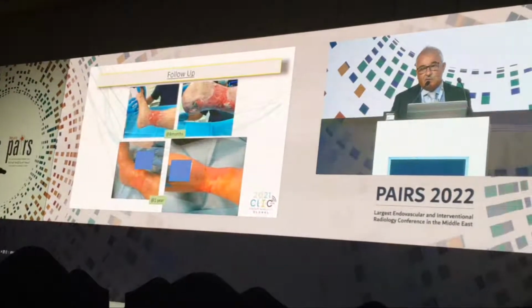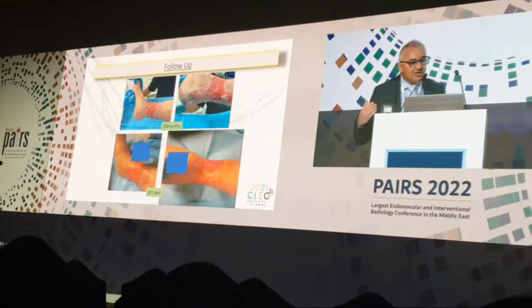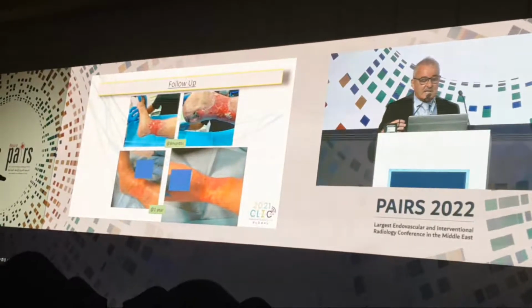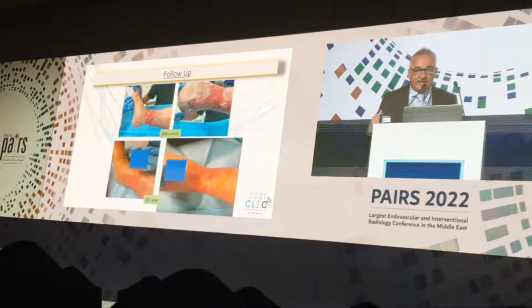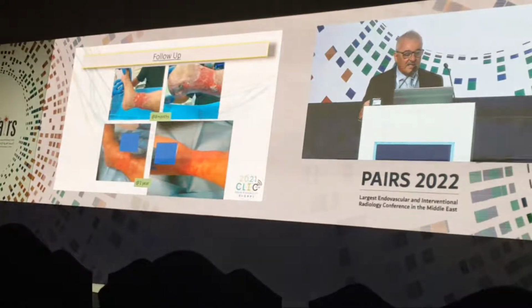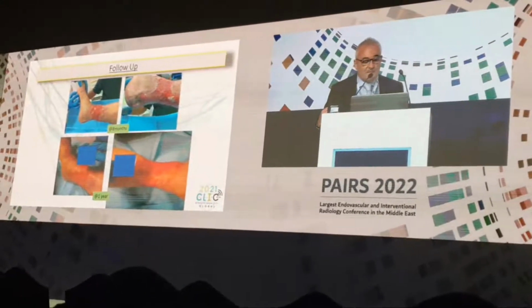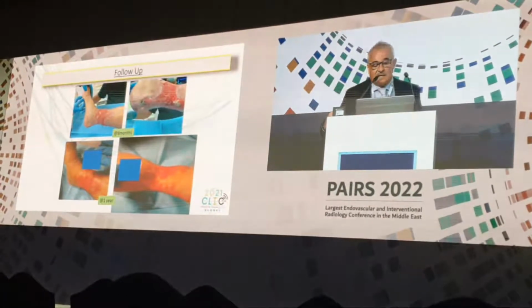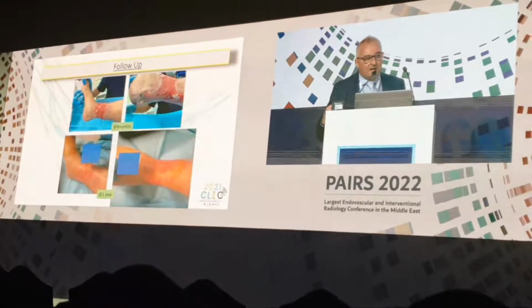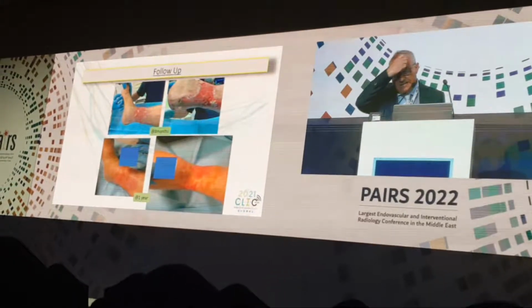And this is the follow-up of the patient. You can see here the progression of the wound healing process. You can now better see the extension of the wounds towards the heel and the calcaneal area. The first two pictures are after 8 months and the last picture after 1 year. This patient was enrolled in the Biblios study.